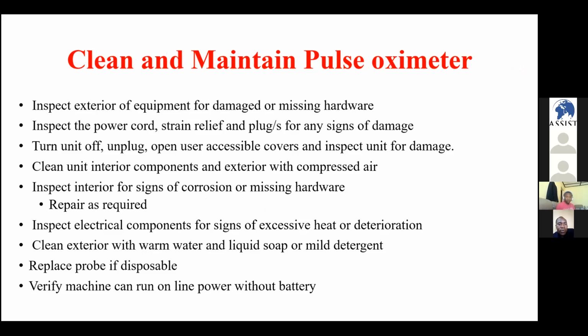So the last part of this first part of the presentation is about the cleaning and maintenance of pulse oximeters, because you don't want them to get damaged or be the means of spreading infections. You have to clean them and avoid any possible damage. So you have to do an inspection of the exterior part of the equipment to see if anything is damaged or something is missing.